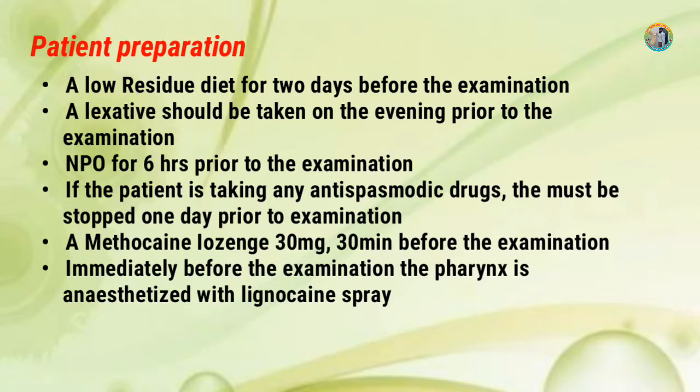Patient preparation: a low residue diet for 2 days before the examination. A laxative should be taken on the evening prior to the examination. NPO for 6 hours prior to the examination.